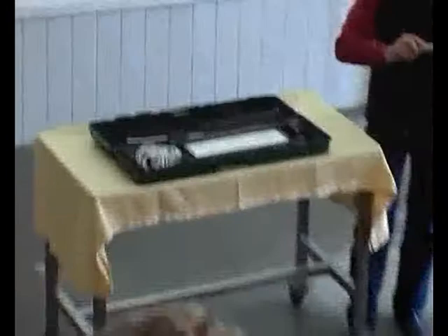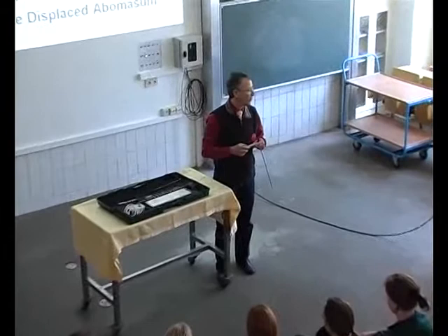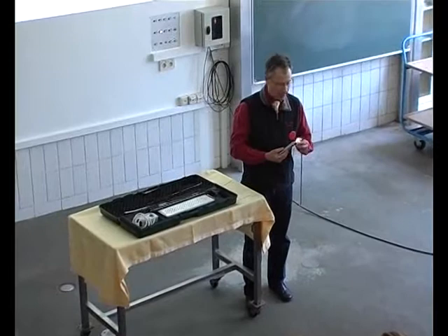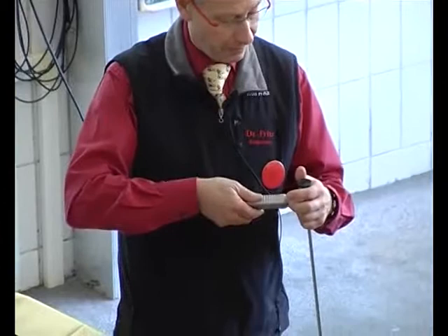At the same time, we have a new type of light source, which is an LED light source. In field practice, this is absolutely enough. For use with video cameras like we do today or like we did today, this is naturally not enough. But for the field practice, it's fine. This one is a light source. It has an accumulator or a rechargeable battery in it, and it has a charger facility in it, and it just screwed on top of the scope.